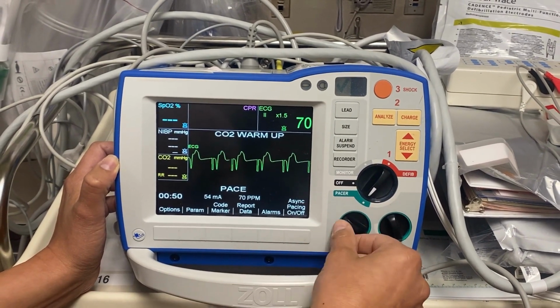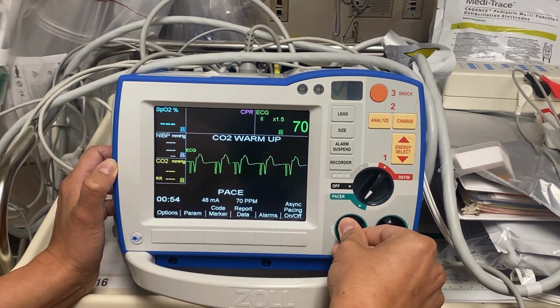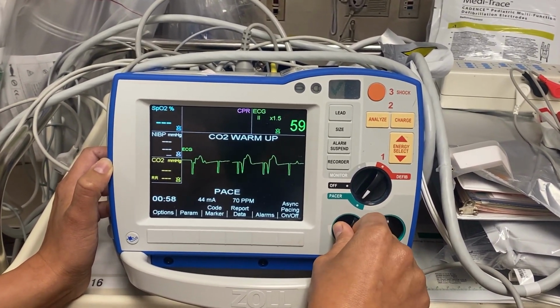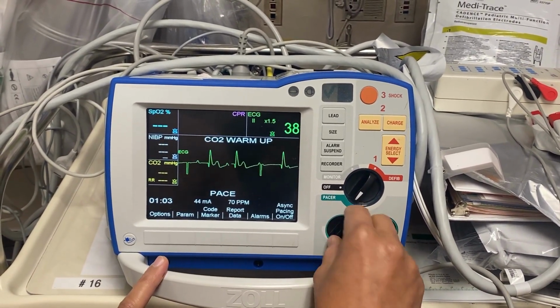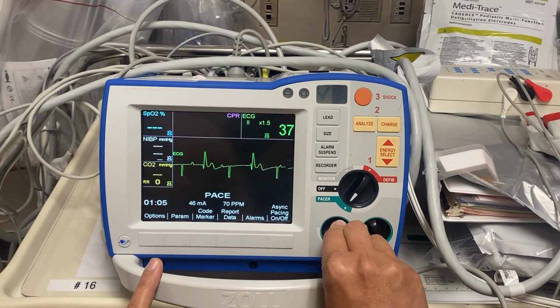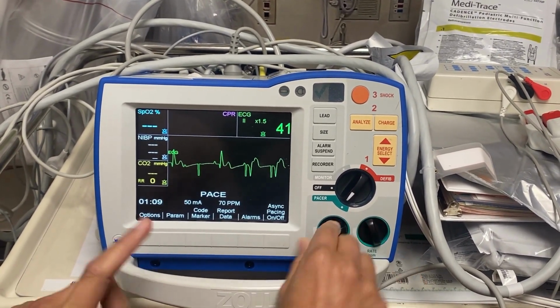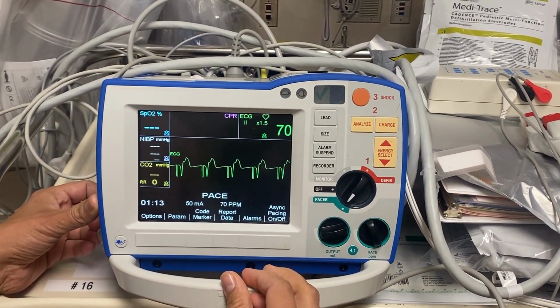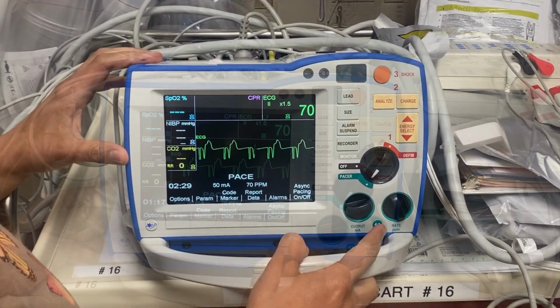As we start capturing here, we're going to go slowly down until we lose the capture. As we just lost the capture over here, now we're going to go up by 10% in milliamps to keep the capture. Going down, that is usually the threshold for the patient. So we go up 10% just to keep the capture.